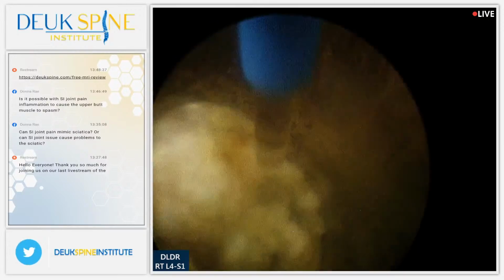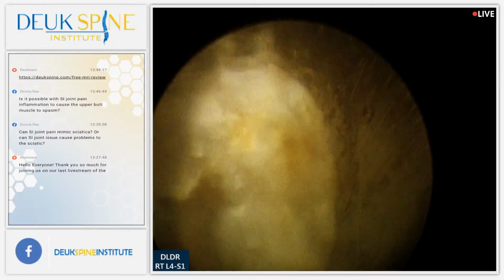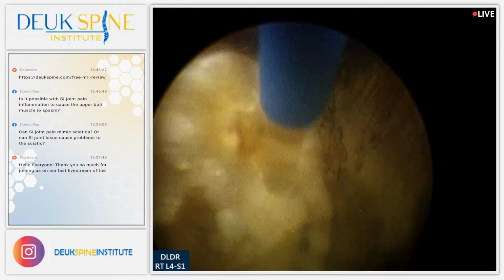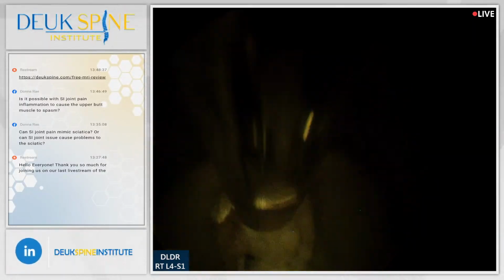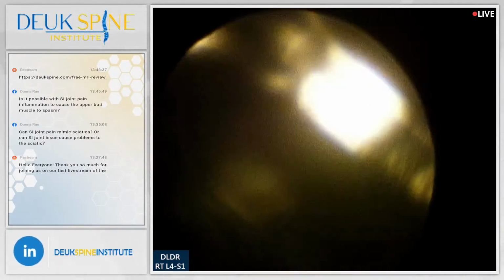So, Duke plasma rhizotomy, permanent elimination of SI joint pain. It works 95% of the time. There's a few cases where the nerves are buried so deep in the joint they're very hard to get to. We've had to repeat the procedure, but every time we repeat it, it's successful. So I would say the procedure is very, very successful, the Duke plasma rhizotomy, and that's what we're going to do for this young man once we're done fixing his 2 discs.